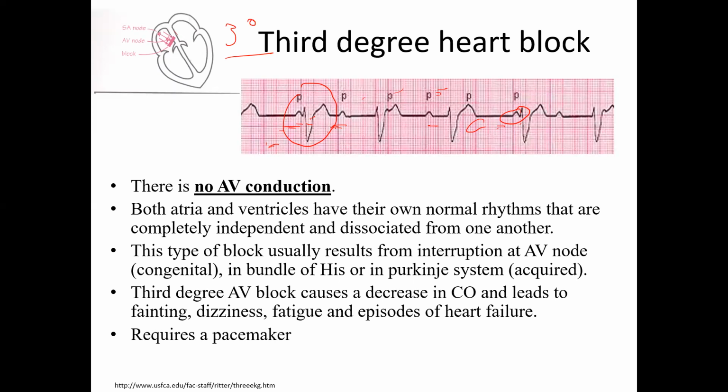And then you look at each one, well, P wave, and then we have a delay. And then there's a P wave, another delay. And you could have 2 P waves and a loss of a QRS. Well, actually, this is a P wave here, which is hard to see. Really hard to see right here, but I wouldn't do that to you. But there are more P waves than there are QRSs. So this is a complete heart block, and this is why it doesn't look normal.